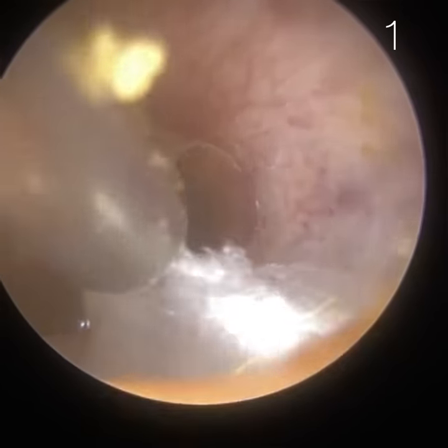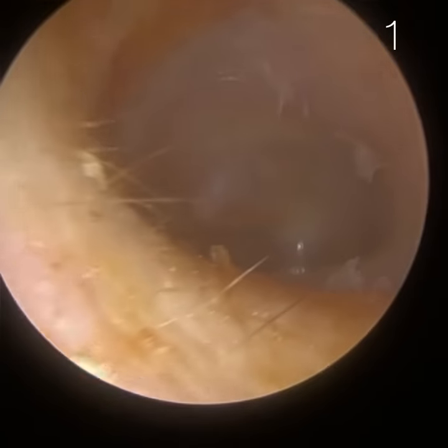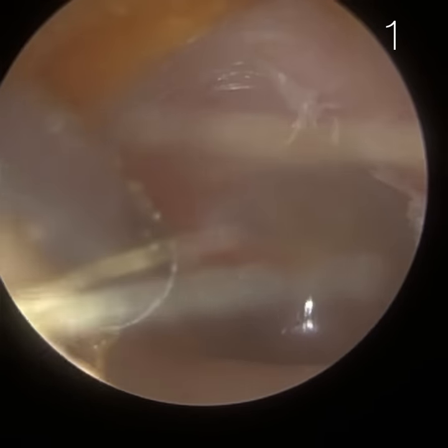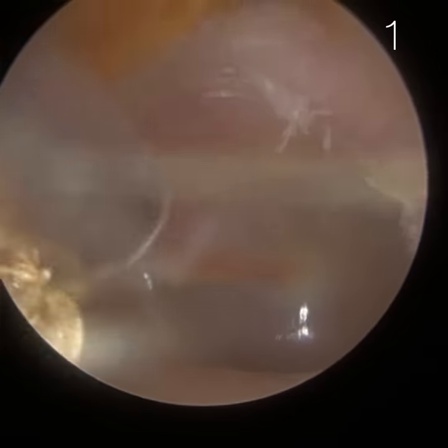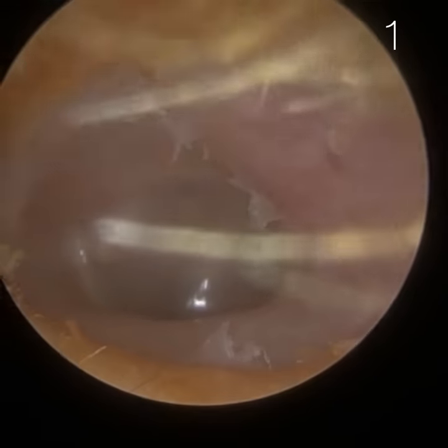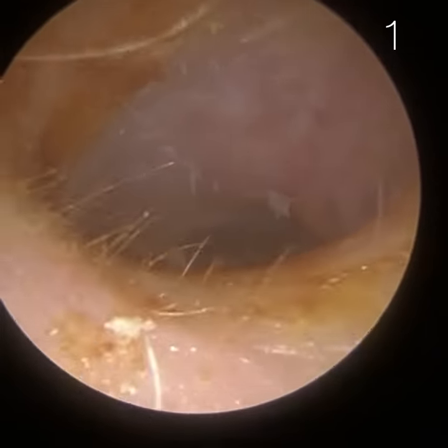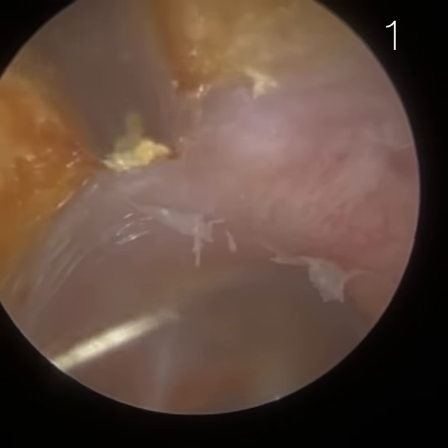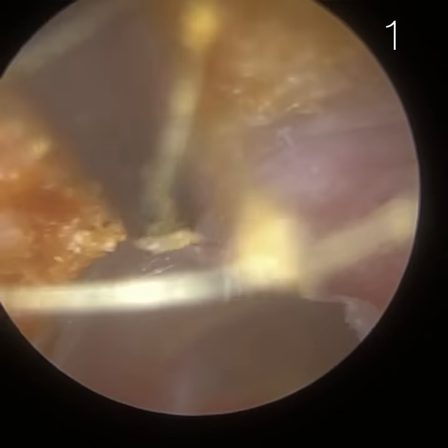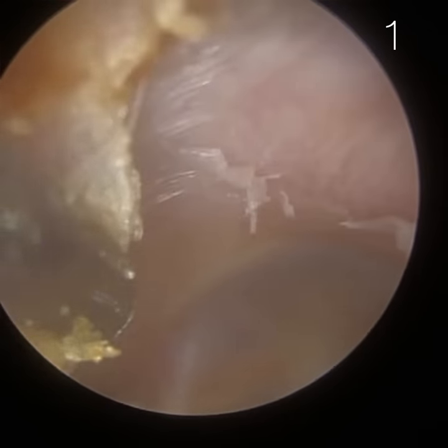This skin is not really going to cause any massive issue, but it potentially may not migrate by itself, and that's why this patient's left ear had originally had a plug of dead skin and wax forming. The skin that lines the ear canal, as it dies and sheds, has developed over millennia the unique property of ensuring it moves sideways as it migrates away — almost like a conveyor belt. Any wax sitting on the surface of the skin is therefore also transported out of the ear.